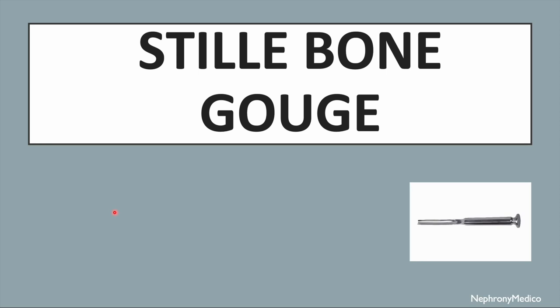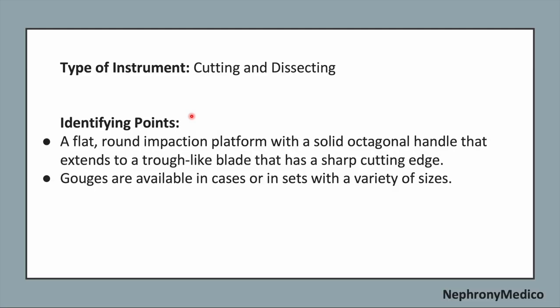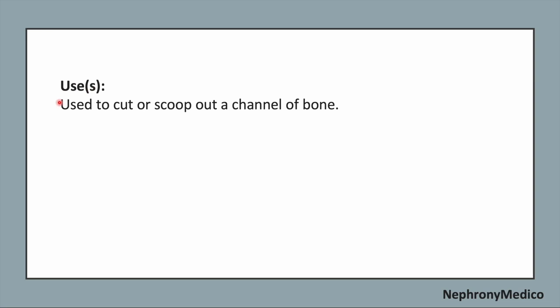Let's talk about Stille bone gouges. This is a picture showing Stille bone gouges. It is a cutting and dissecting type of instrument. Now, identifying points: a flat round impaction platform with a solid octagonal handle that extends to a trough-like blade that has a sharp cutting edge. The gouges are available in cases or in sets with a variety of sizes. Use: it is used to cut or scoop out a channel of bone.